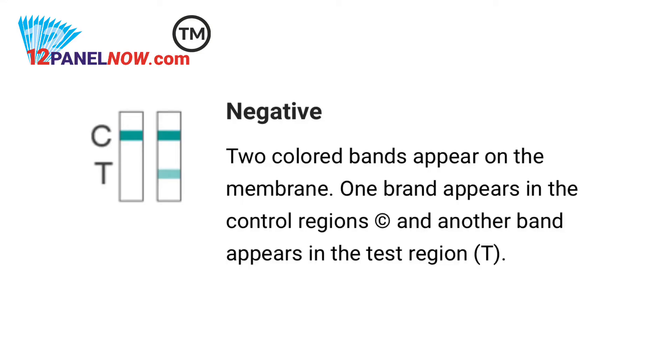After five minutes or so, you can start reading the results. For a negative result — no LH surge — only one color band appears on the control region, or the test band appears but is lighter than the control band. This means there is no LH surge.